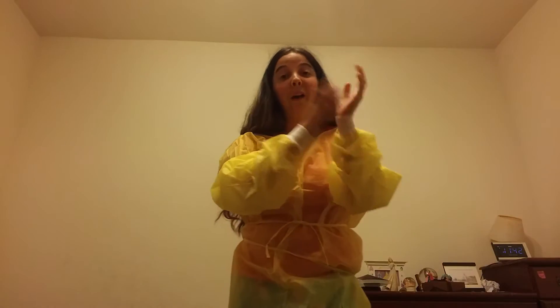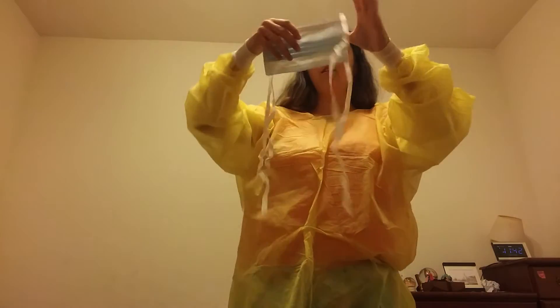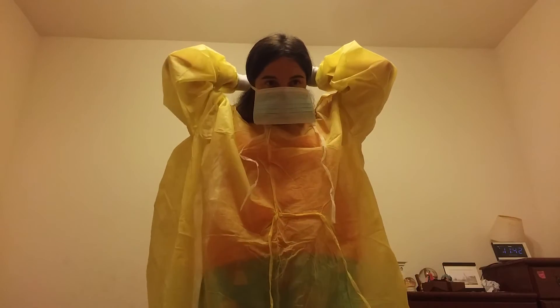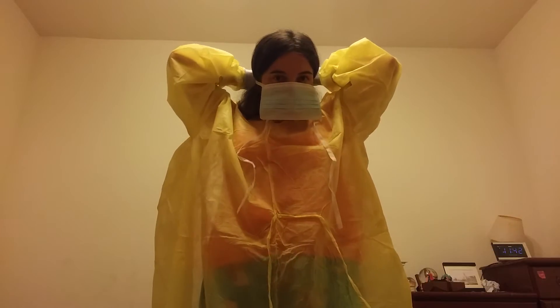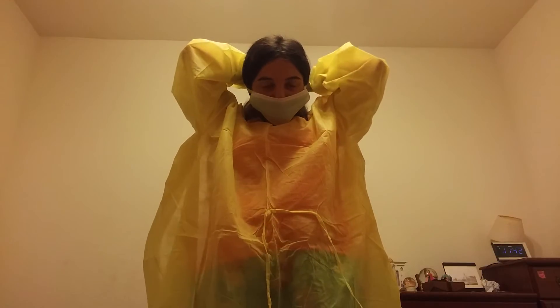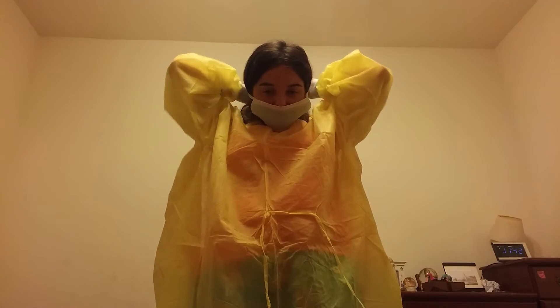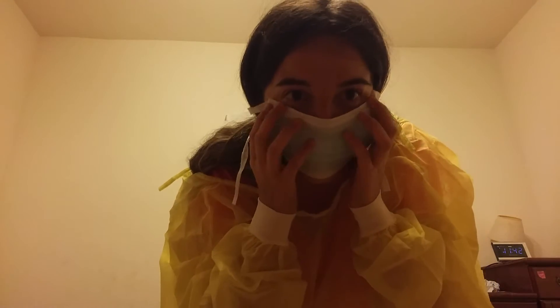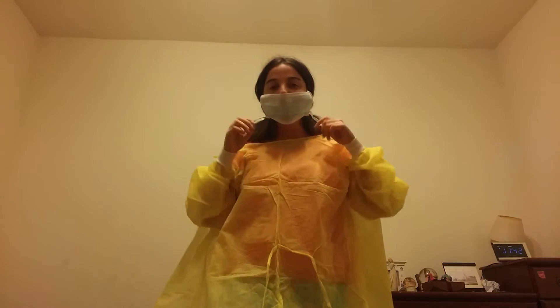Okay, so now that you have the gown on, you should also have your gloves on — even though I don't have mine on. Then here's your mask, so you put on your mask this way. I've never put one on before, so let me see if I can do this. Okay, now I have my mask on.